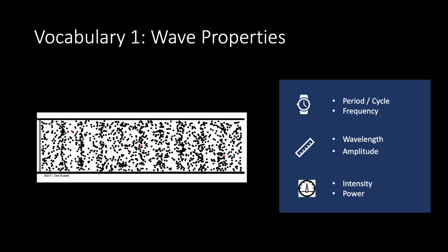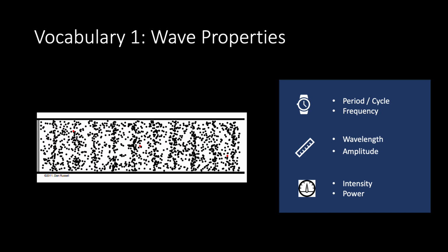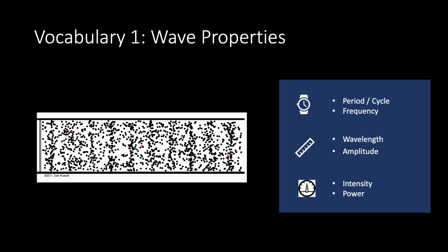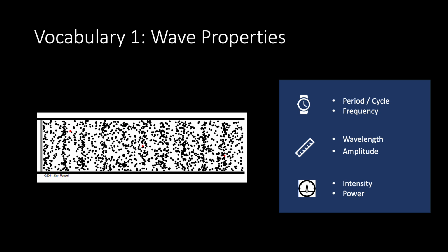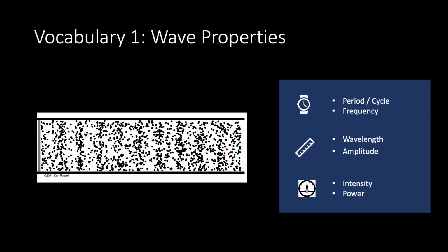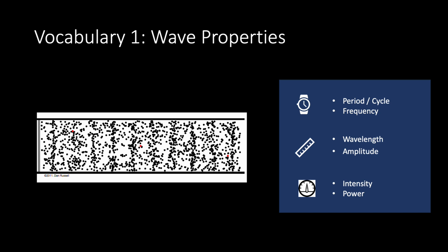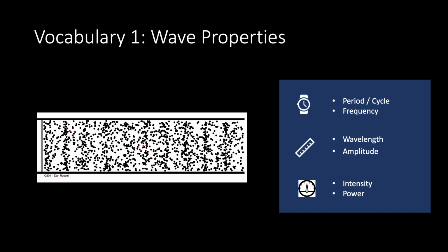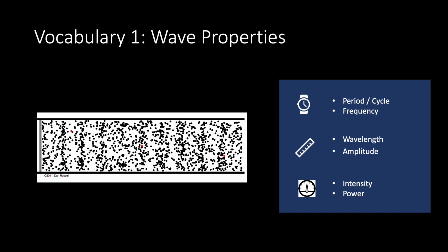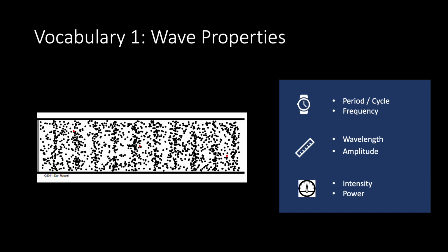And so the larger the area, we divide that energy and apply it over a wider space, thus causing less damage at the individual small levels. Versus power, we can measure that same amount of energy, but as a function of time. We see, if we ultrasound someone for 15 seconds continuously, how much mechanical energy is being transmitted into the body, and we use power to make that representation.